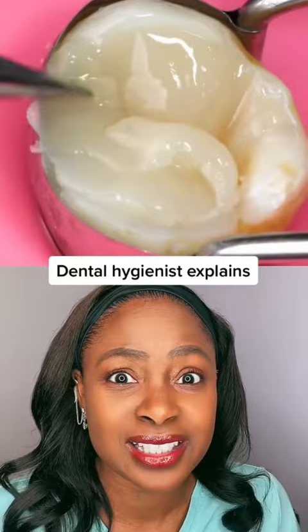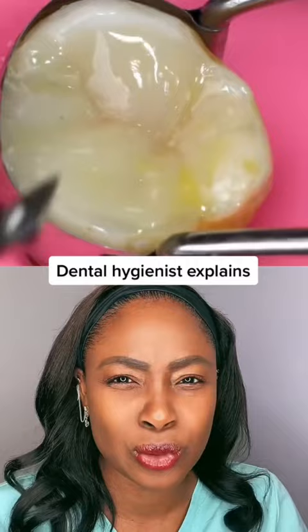Look at this. They're just going to carve that up. It's going to look like nothing ever happened to that tooth. Absolutely beautifully well done. They're going to polish this all up and of course at the end, check the bite and the patient's going to leave good as new. Look at that.